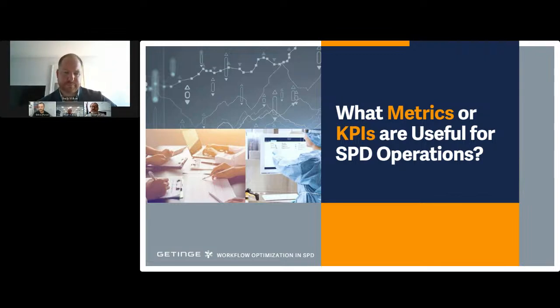What trends are they seeing on their end, from an OR infection or other house-wide infection that we process for, in order to focus us on what we need to pay closer attention to. So whether it's immediate use data for sterilization, cleaning metrics, or time and motion studies, there's numerous things we can pick. But those are some of the critical aspects that I'll leave you with, and give a few other folks an opportunity here.